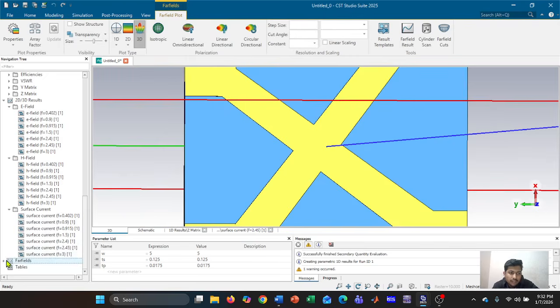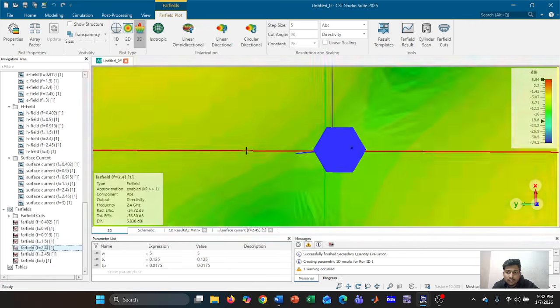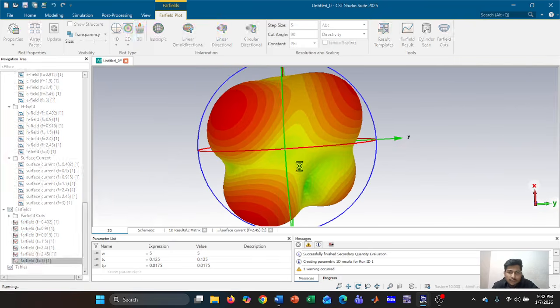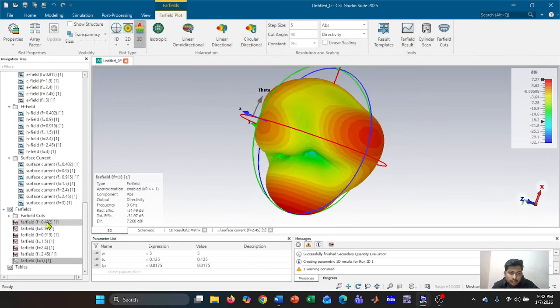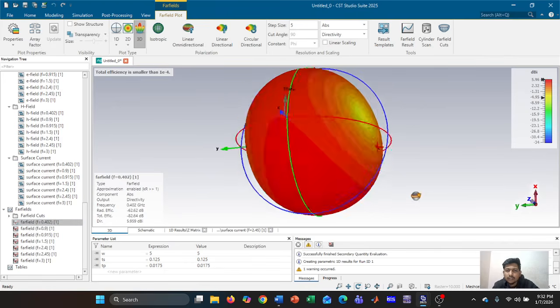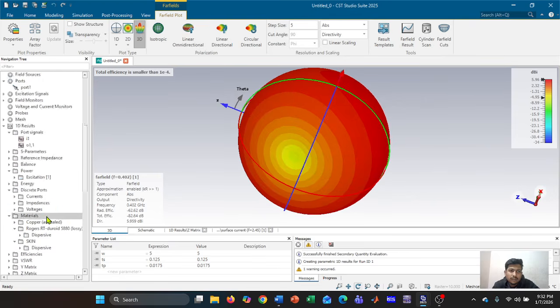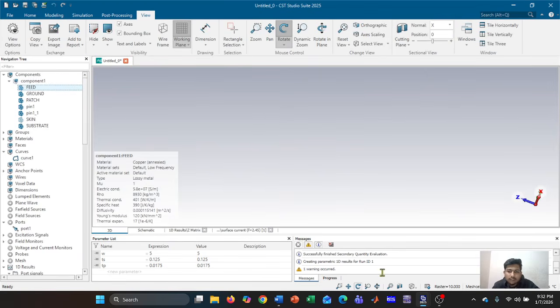The interesting one is far field. You can see the 3D view of far field for 2.4 gigahertz frequency. For 3 it is like that, and for the minimum I selected it is almost rounded, spherical type. So this is my antenna design. Okay, thank you.